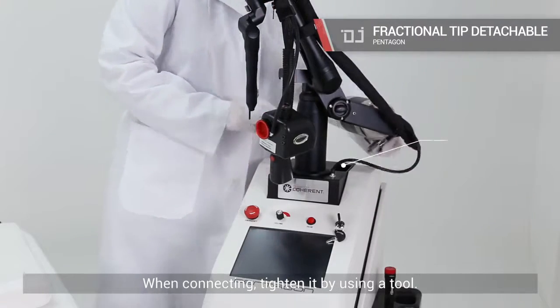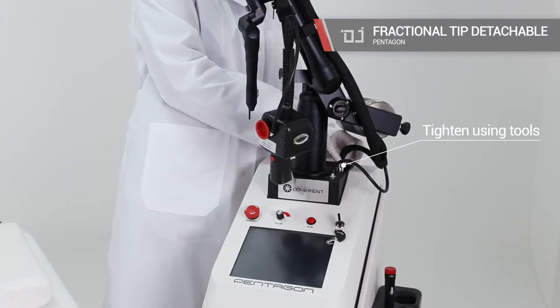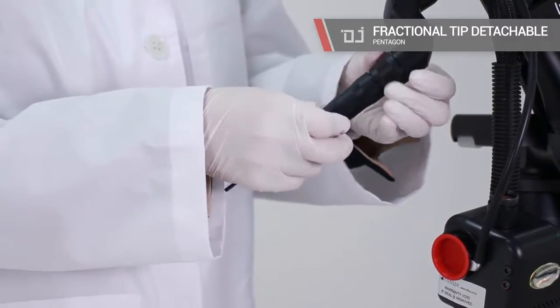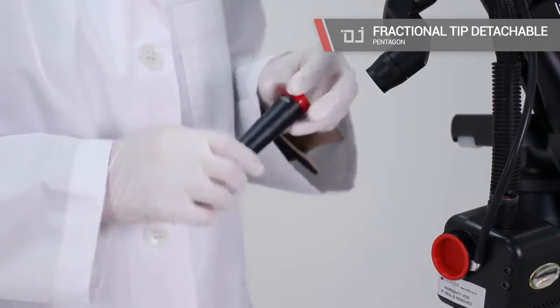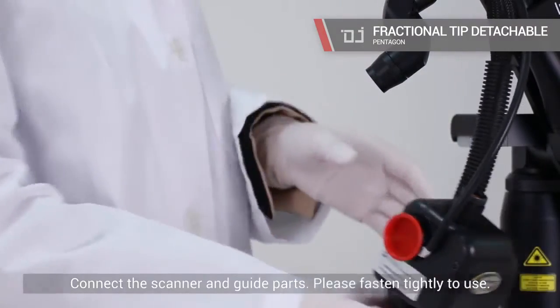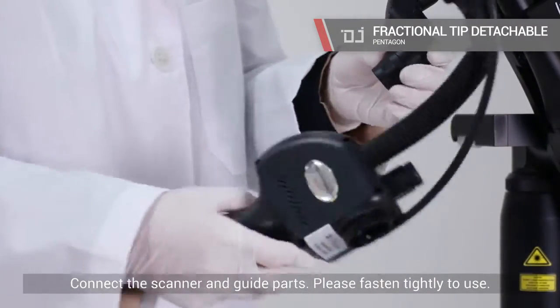When connecting, tighten it by using a tool. Connect the scanner and guide parts. Please fasten tightly to use.